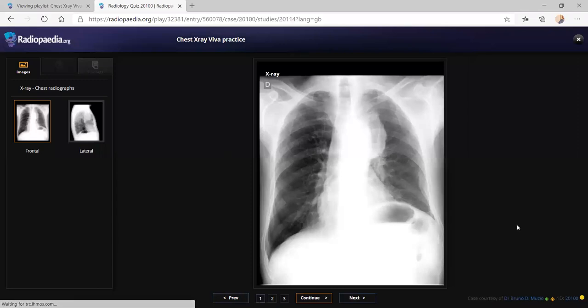And this one, actually, it's an opening film. Opening films are always very simple. You took more than 4 minutes, maybe 4.5 minutes for this. You are going in one direction, coming back, going in another direction, and again coming back. When you start describing a lesion, when it is obvious, you finish describing that lesion. You told that there is some mediastinal lesion, and then you went away to the lung.